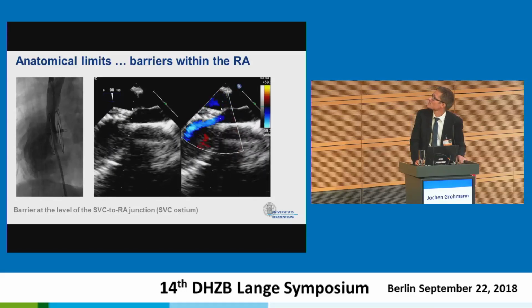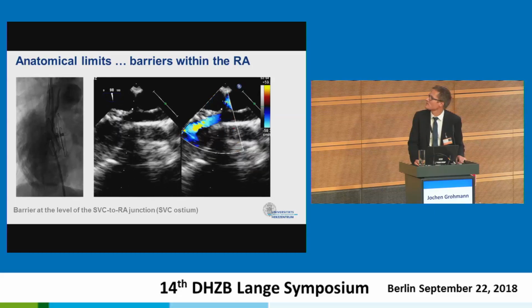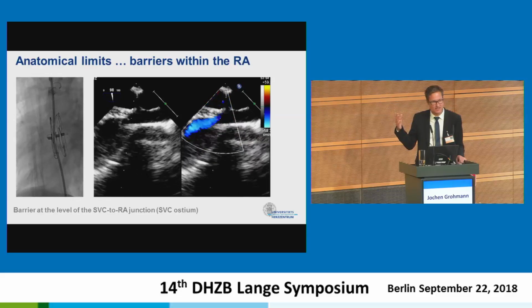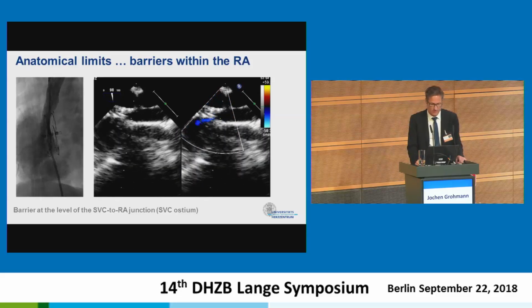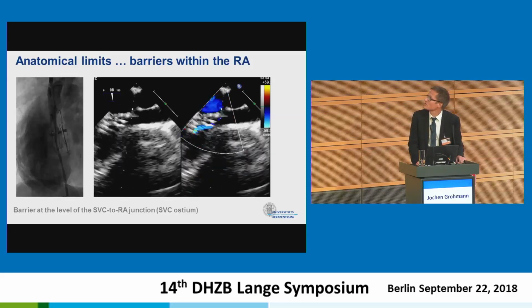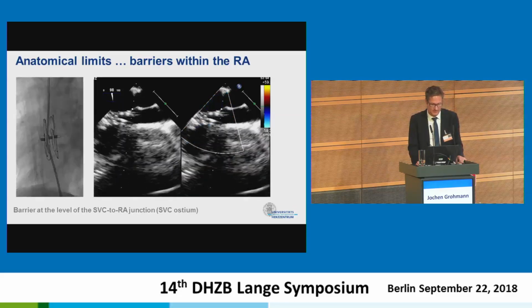So it was possible to get rid of this, but this can be difficult as well, especially for devices as here, where the right atrial disc is as large as the left. So maybe an Amplatzer device or similar would have been an advantage, but there was not so much rim at the top of the roof. So this result is good in this case.